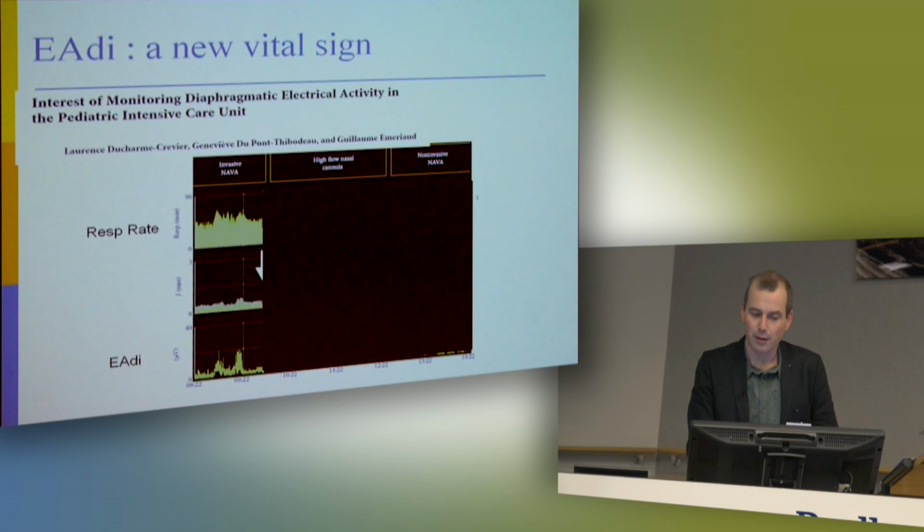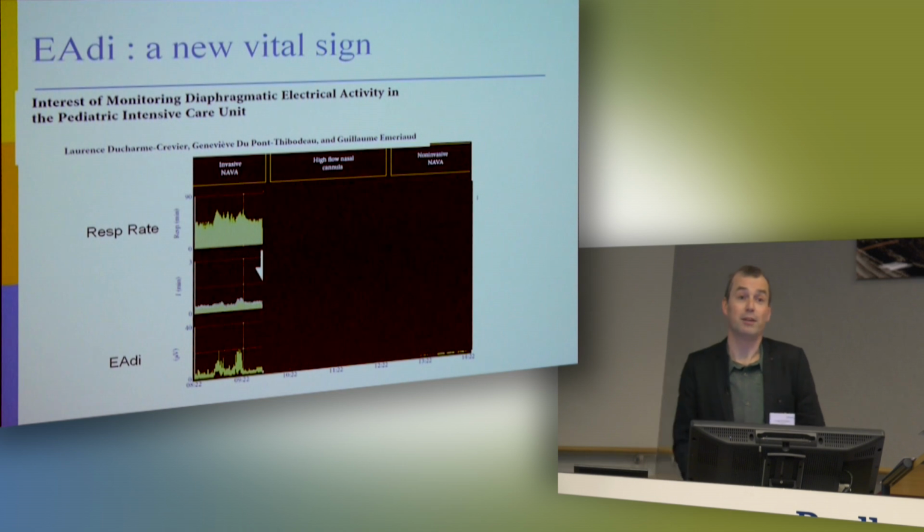When NAVA was implemented in our unit, and I think it's the same in most units where NAVA has been implemented, this has led, in fact, to a change in practice because of this new information that has been made available to the intensivist in clinical practice, and it makes us realize a lot of things.